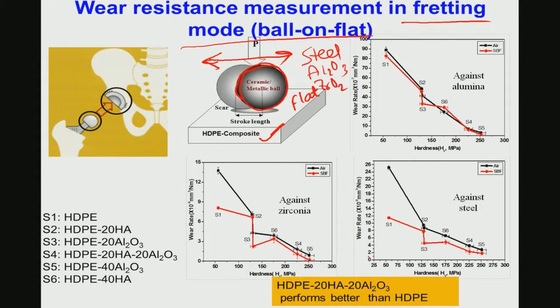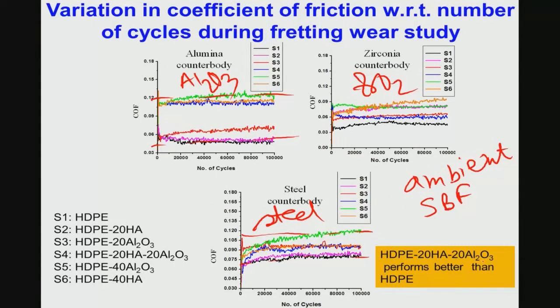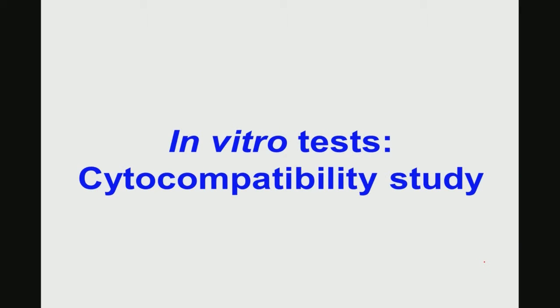Now, in terms of wear resistance, what you notice here is that as you increase the hardness of the flat material, that is, the high density polyethylene with hydroxyapatite and alumina, the wear rate systematically decreases. What it means is that by adding hydroxyapatite and alumina to high density polyethylene, you can increase the hardness of the material, and you also increase the wear resistance of the material without compromising much on the frictional properties.